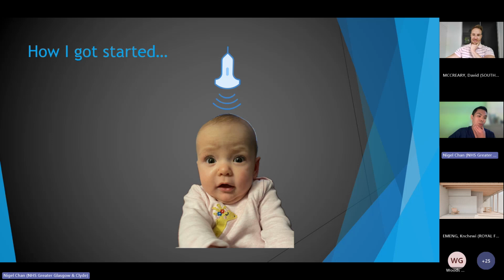I think it's very much not what point of care ultrasound should be. From my point of view, doing POCUS should be helping us to answer relatively easy questions. I'm not trying to do the job of a radiologist. I don't really feel it's our job to be grading hemorrhages 1, 2, 3, 4 and commenting on PVL and all that kind of stuff. And the brain is quite complex anatomy as it is anyway. Whereas from my point of view, it should be an extra piece of information for my clinical assessment.